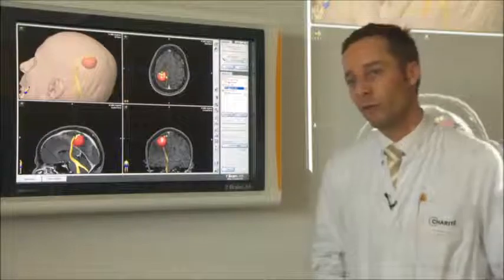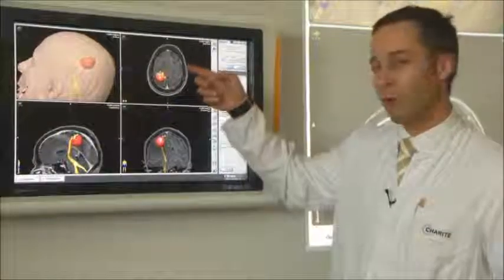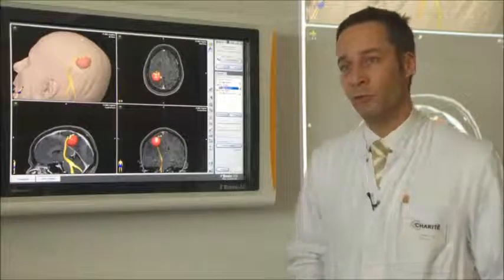So we figure that we should approach that tumor from the dorsal aspect, going in from here. We have to be very careful at the frontal aspect of the tumor, and we will perform subcortical direct stimulation there, guided by the results of the functional mapping.